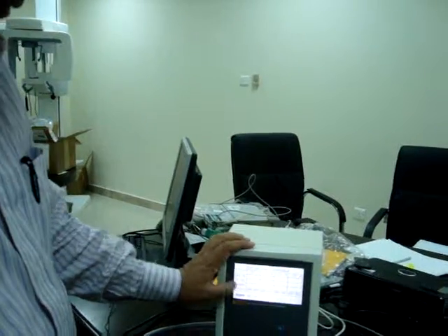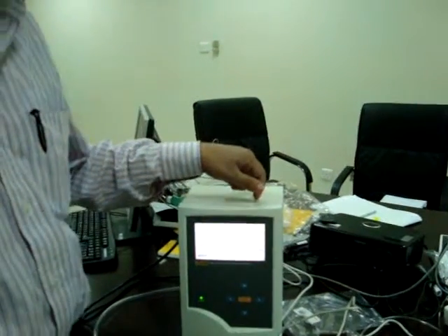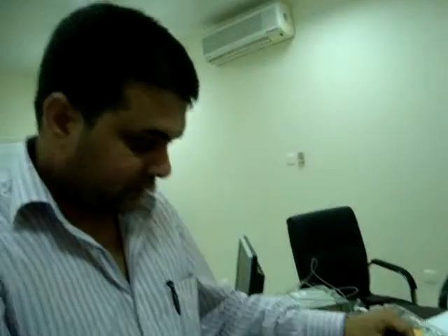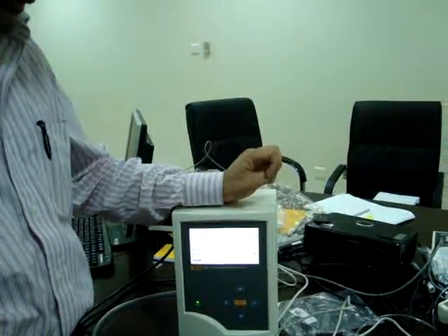Now this time is not related to your clock. That is put at the top to tell you which date and time you did the test, but this is the time duration for the test. Those two clocks are different.